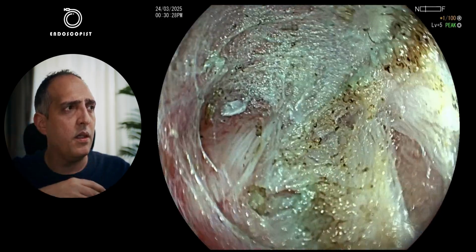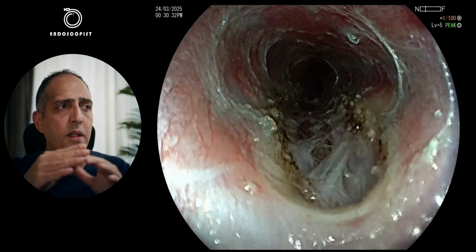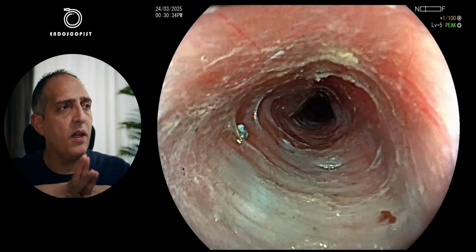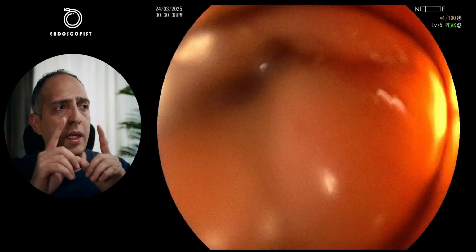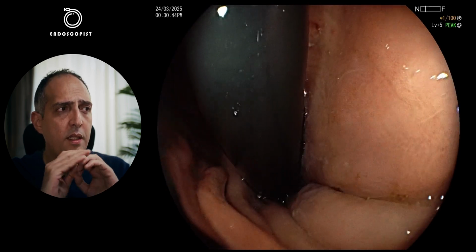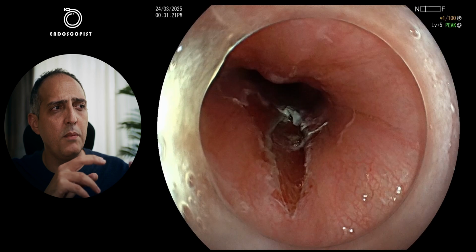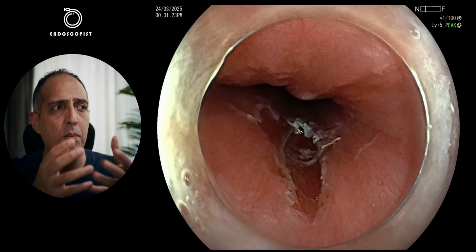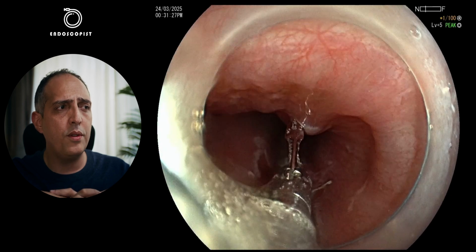I will have a look at the penetrating vessels, go back, making sure that there are no circular muscle fibers anymore. Making sure again that the whole mucosa is intact. I will have a look at the cardia in inversion. As you can see here, it is resembling a small incompetent cardia, which is a good sign. Now the closure is very important.